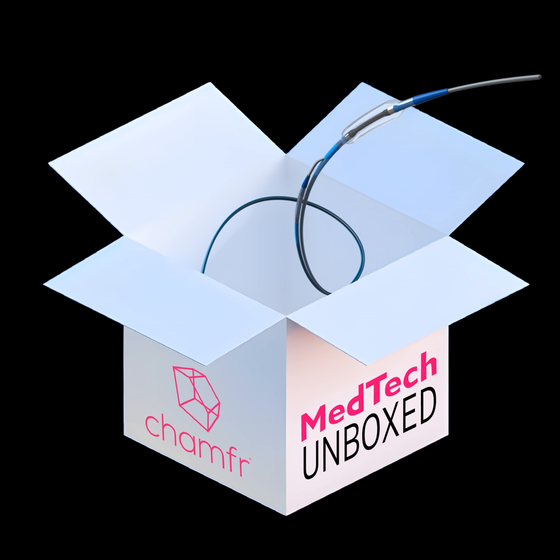Very interesting. So you could do up to 4-wire steerable or just mono. Okay. Yes, 4 wires.